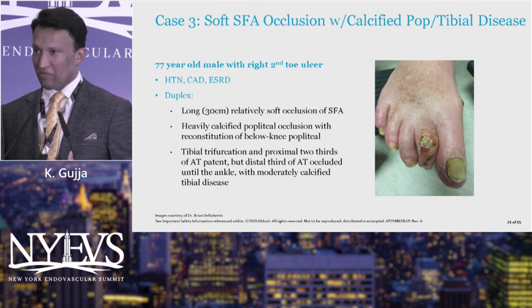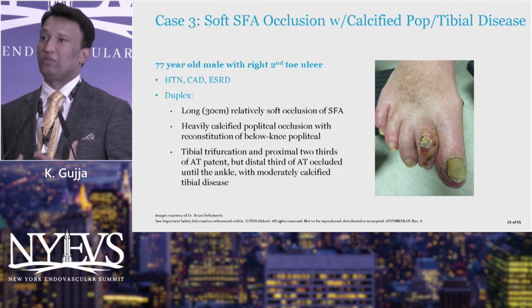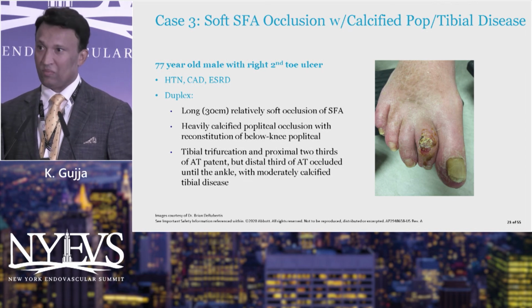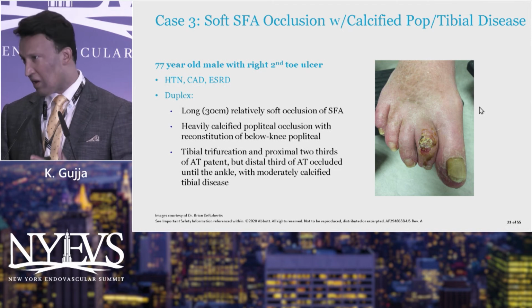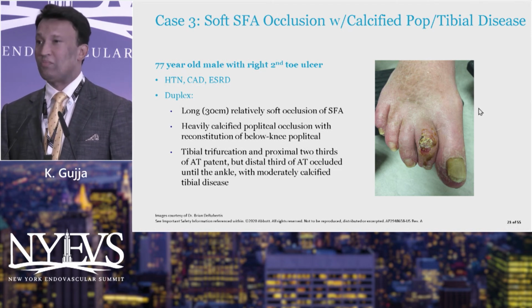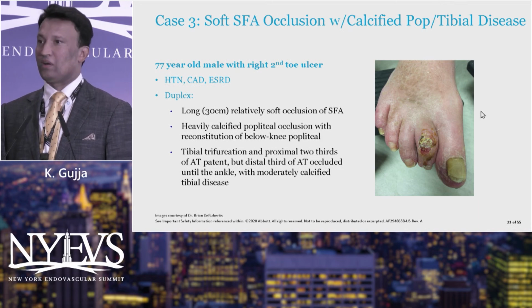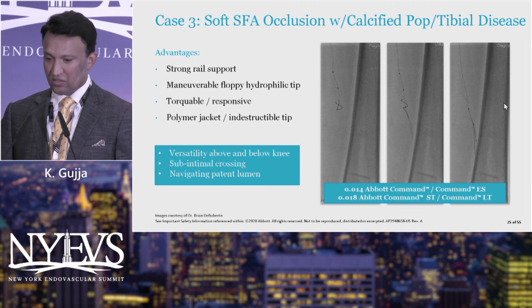Short lesions, I would definitely say use specialized wires, cross it, because you can stent it, you can get a better patency and everything, understandable. But if it's a long segment lesion, as Dr. Krishnan said, you're just wasting time. As long as you don't spiral your dissection down and create multiple dissection planes, you're totally okay with creating a dissection plane. So again, I'll just skip some.